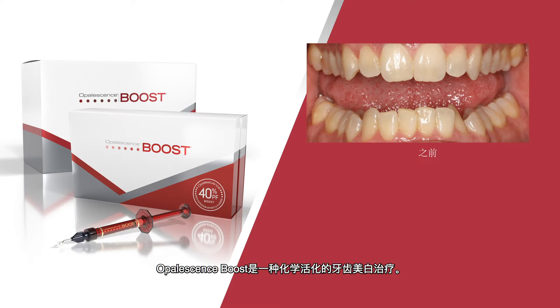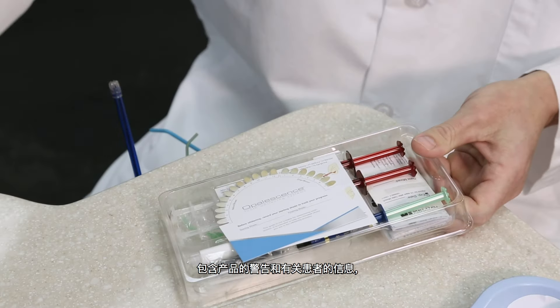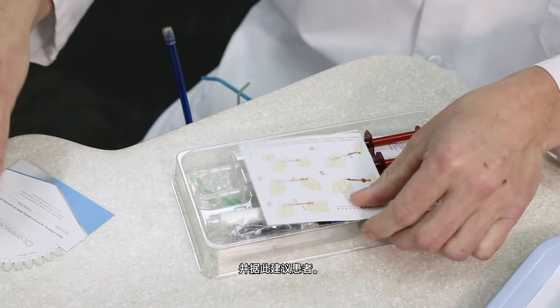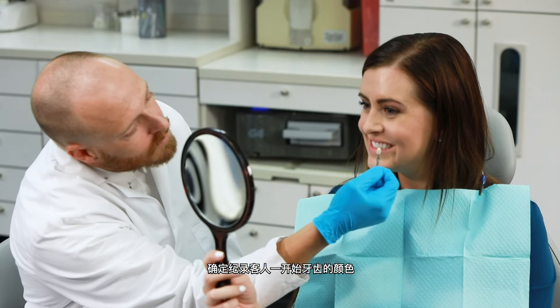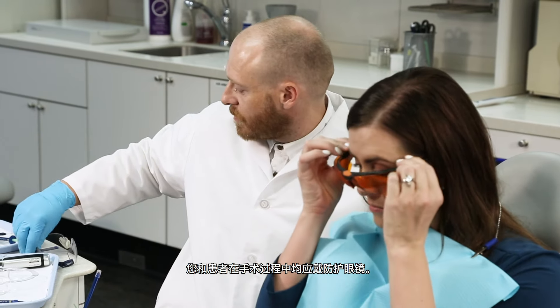Opalescence Boost is a chemically activated in-office tooth whitening treatment. Be certain to read the product instructions, warnings, and information for the patient contained in the package, and advise the patient accordingly. Determine the patient's initial shade for your records. Both you and the patient should wear protective eyewear during the procedure.